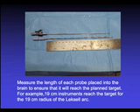We don't actually take biopsies with this device, but one can determine if there's any bleeding at any point along the trajectory. It's important always to measure the length of a probe before it is passed into the brain. For the Leksell stereotactic system, the radius of the arc is 19 centimeters, and most, but not all, of the instruments have a functional length of 19 centimeters.